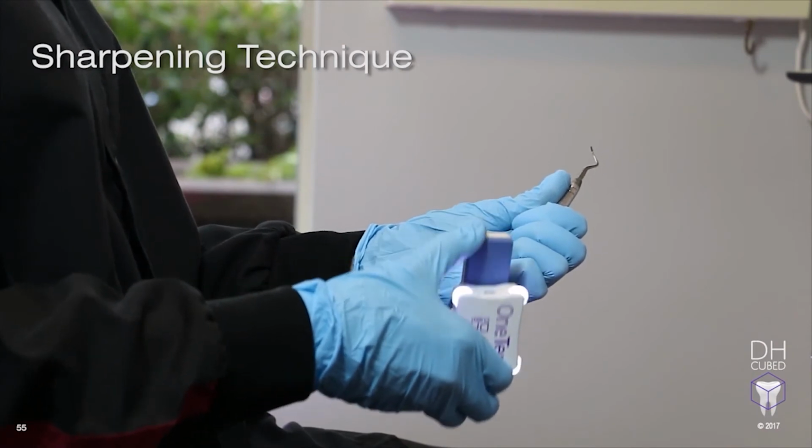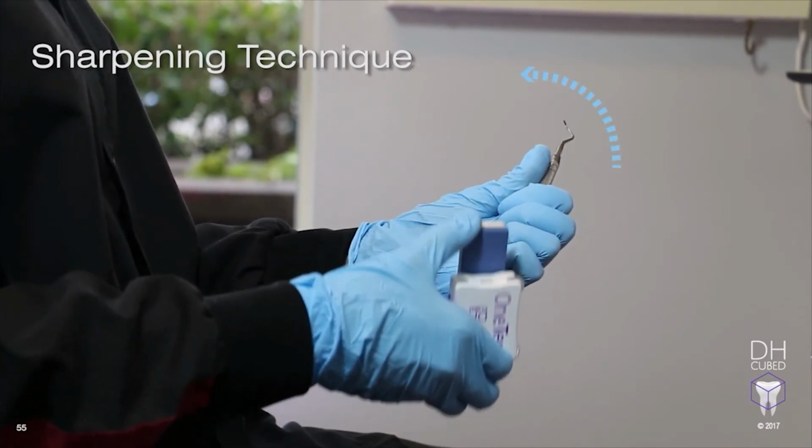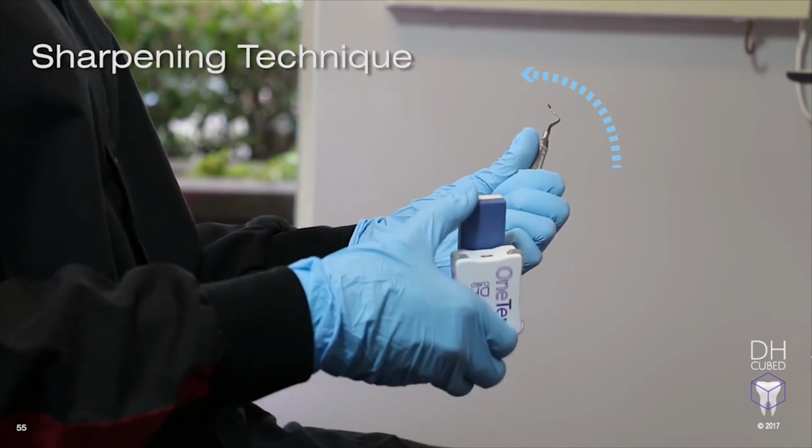You want to see the face at all times. This will require rotating of the instrument as you continue sharpening the cutting edge towards the tip. Begin sharpening the first 2 to 3 millimeter increments. Move the stone up and down in short, controlled strokes. The 110 will not work well when using long sharpening strokes. Be sure your elbows are firm against your side to stabilize both hands. Watch the 110 lights to be sure you are staying at the 110 degree angle. Eventually, you will be able to see the lights out of your peripheral vision and will only have to concentrate on keeping the face parallel to the floor.